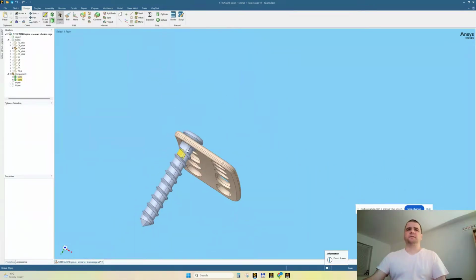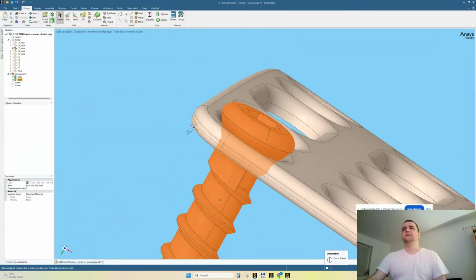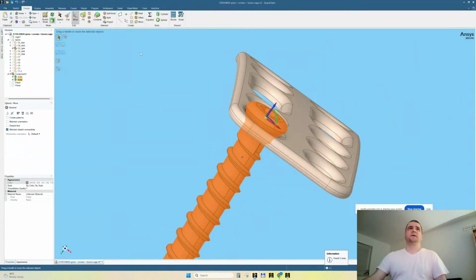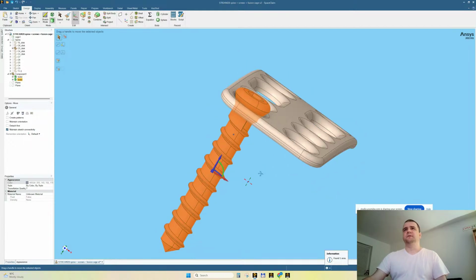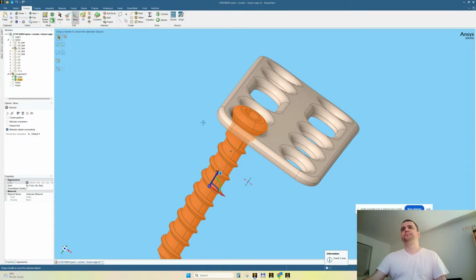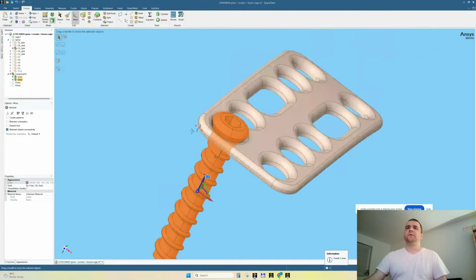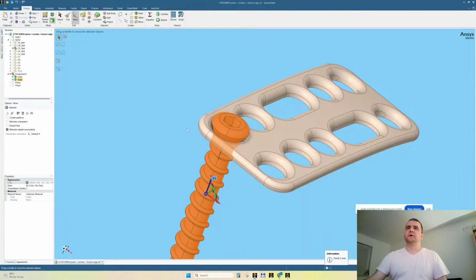All right. Yeah, I have seen better screws. This is what happens when you take free stuff. I said let's rotate it, but let's rotate it kind of from the middle, you know. 1 degree. Oh, 0.5. Oh, yes, it's kind of 0.4.